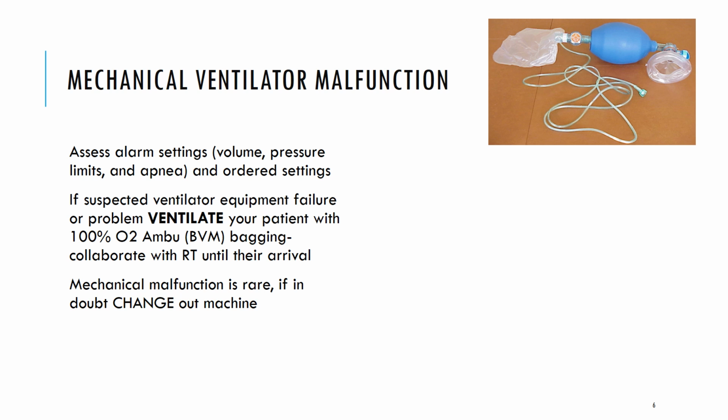But what else do you see? Oxygen tubing. We do not want to just ventilate these patients with room air. We need to hook the Ambu bag or the bag valve mask up to oxygen in the patient's room and then bag them. Now you might notice another dilemma here. The Ambu bag has a mask for a face and a mouth, and our patient has an endotracheal tube. They were just on a ventilator that malfunctioned. So that mask is not going to fit their face.